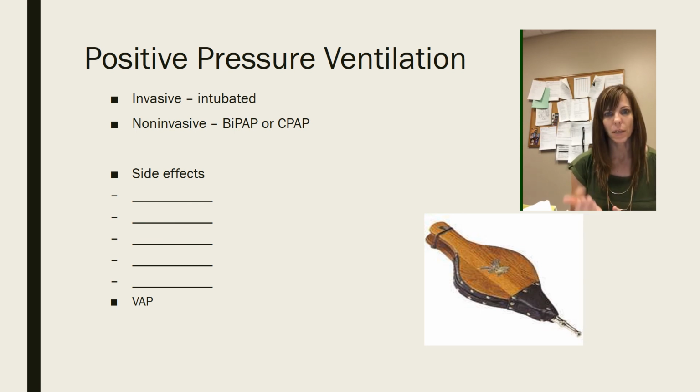But again, we're going from outside the body to inside the body, and we're constantly handling that ET tube. We're suctioning the patient, we're doing oral care, we're moving the patient, we're turning them, we're always touching that ET tube to make sure it's in the right place, and that's all a risk for infection with all that handling.